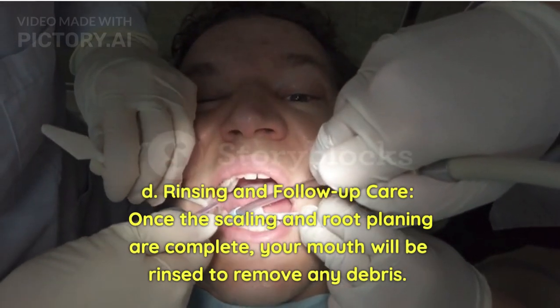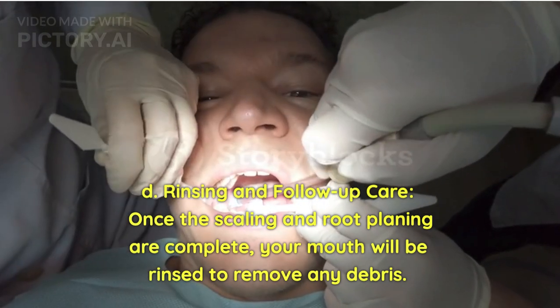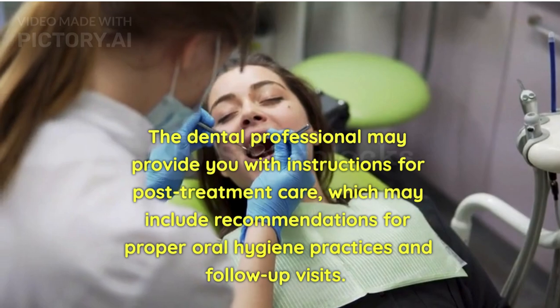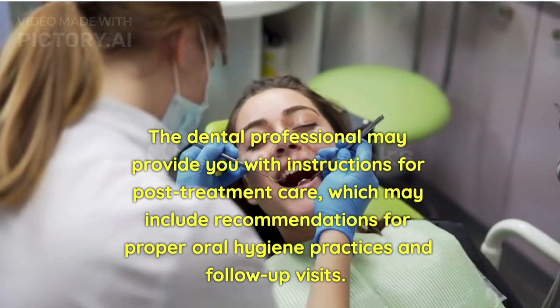Rinsing and follow-up care: Once the scaling and root planing are complete, your mouth will be rinsed to remove any debris. The dental professional may provide you with instructions for post-treatment care, which may include recommendations for proper oral hygiene practices and follow-up visits.